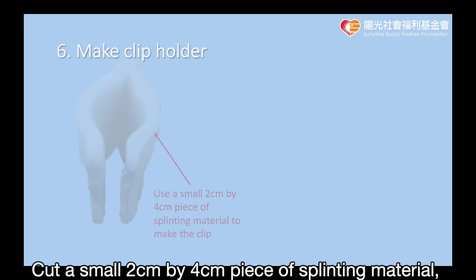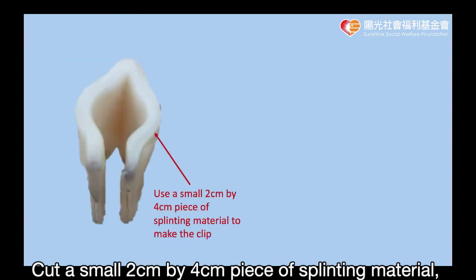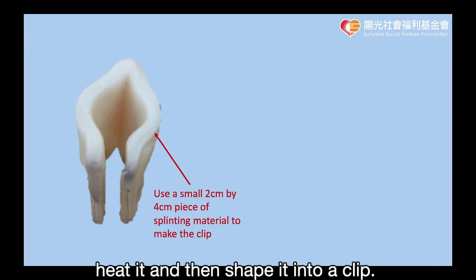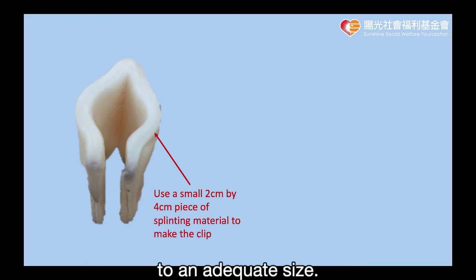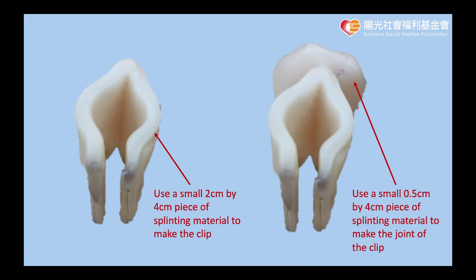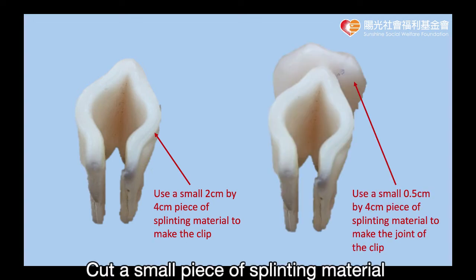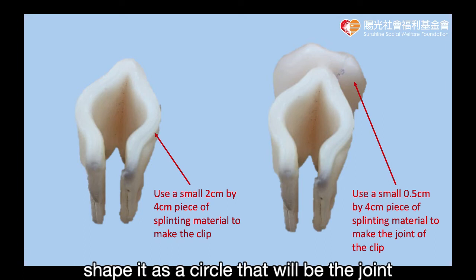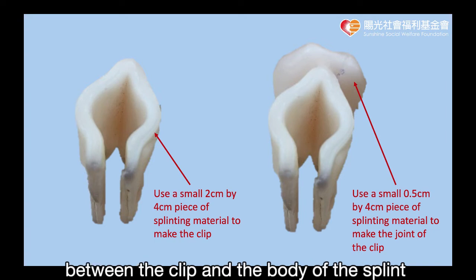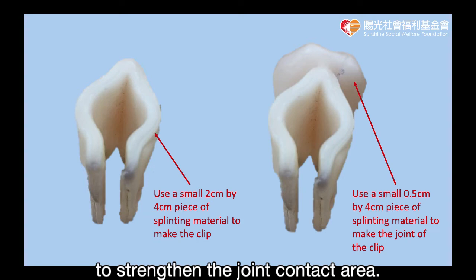Wrap the rest of the loop over the splint and fasten it to the outer adhesive velcro hook. Cut a small 2cm x 4cm piece of the splinting material, heat it, and then shape it into a clip. An object like a pen can be used to shape the opening of the clip to an adequate size. Cut a small piece of splinting material about 0.5cm x 4cm, and shape it as a circle that will be the joint between the clip and the body of the splint to strengthen the joint contact area.